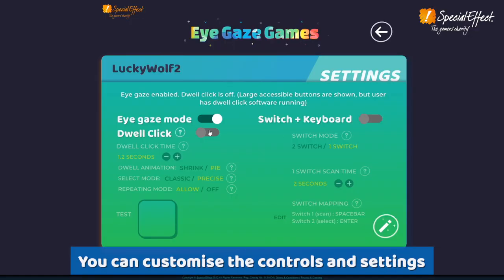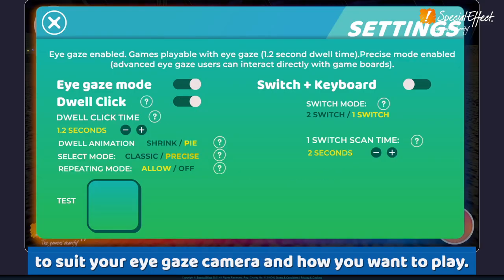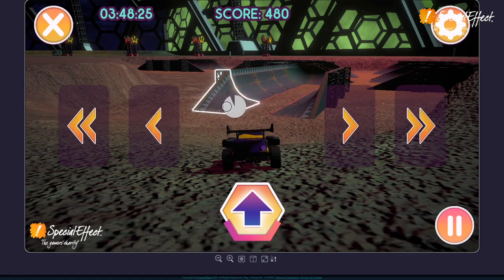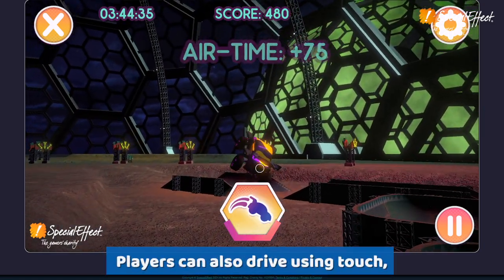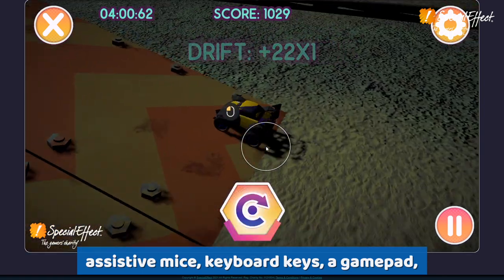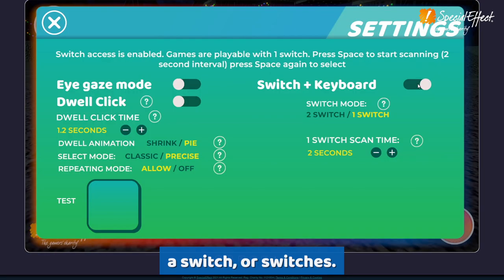You can customise the controls and settings to suit your EyeGaze camera and how you want to play. Players can also drive using touch, assistive mice, keyboard keys, a gamepad, a switch, or switches.